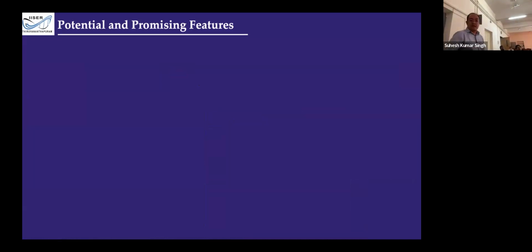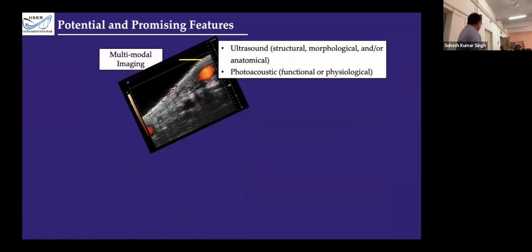And then lastly, it facilitates the development of multimodality. As far as imaging for clinical applications is concerned, the new direction we are expecting is the combination of all these imaging modalities. The idea is that if we go to the clinics, you take the ultrasound, then the CT, MRI, and patients go one after another. Instead of this, you just go to one room, where everything would be there in one imaging system. This is combining all the imaging together. In this way, photoacoustic imaging is a good candidate to develop multimodality.